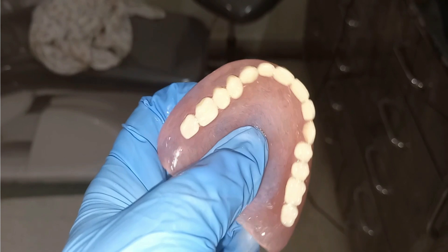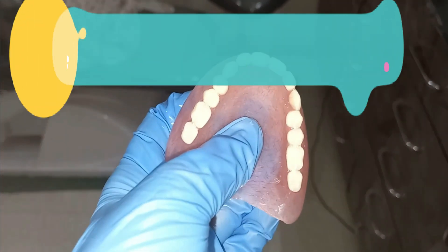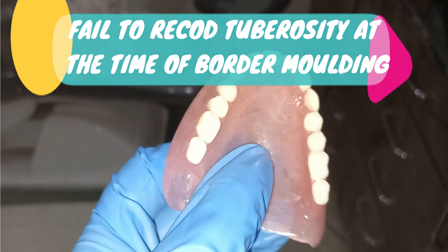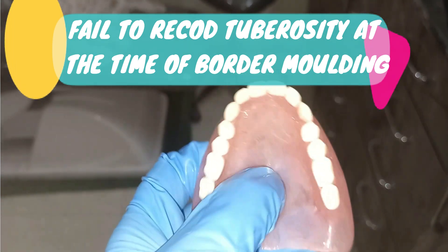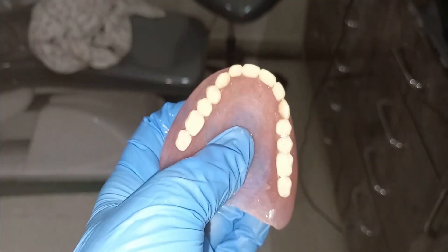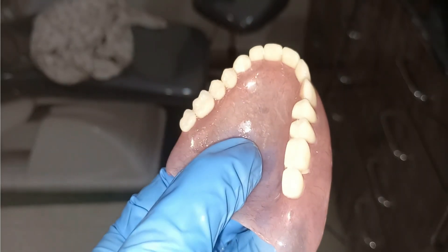If the denture dislodges at the maxillary tuberosity region, it means the tuberosity is not completely recorded. You have to record the tuberosity completely and check whether border molding is done properly. All these steps of retention and stability are checked at the time of the trial denture.